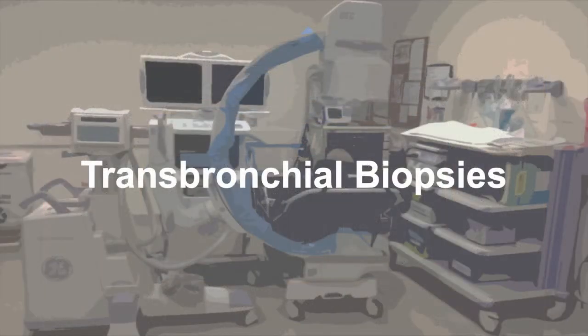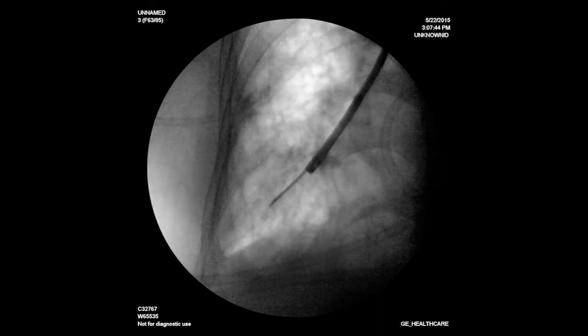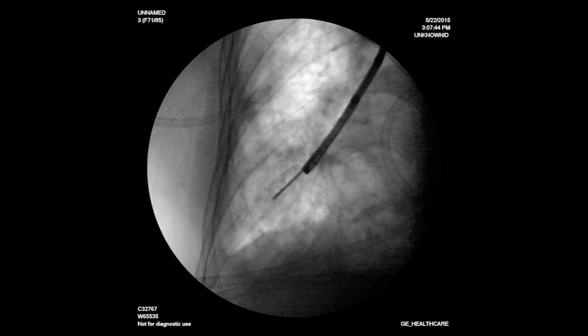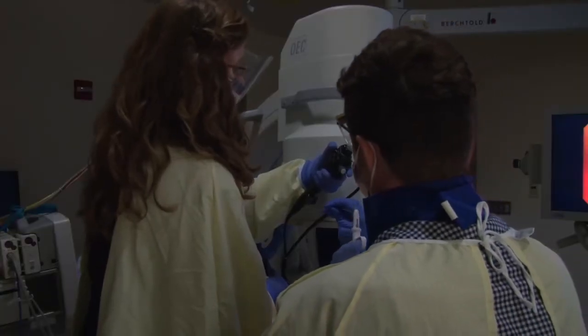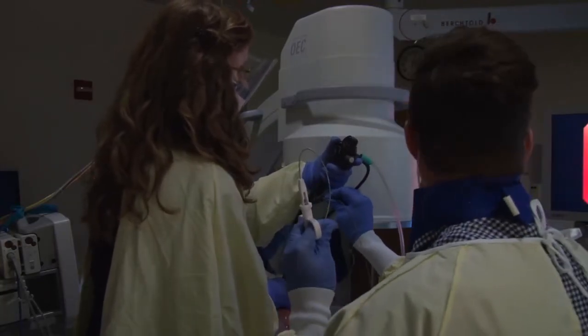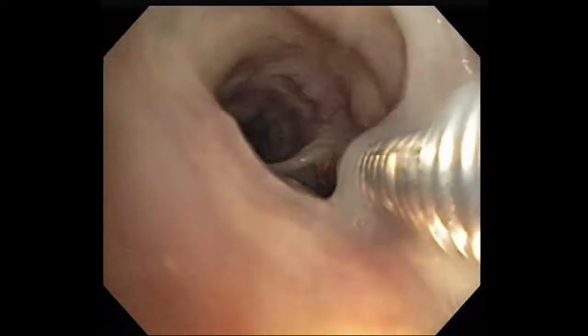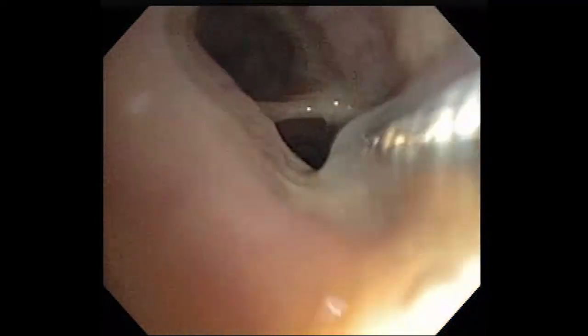Bronchoscopists vary in how they use fluoroscopy when taking transbronchial biopsies. Some just tap the fluoro pedal to get a single image showing the forceps location when taking the biopsy, while others prefer to watch all of the movements of the forceps under fluoro. Let's start by reviewing this approach. Once you've maneuvered the bronchoscope to the right airway, insert the forceps into the working channel and watch the forceps enter the subsegmental airway of interest.